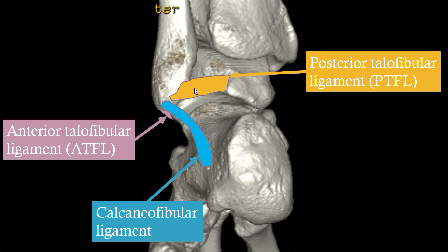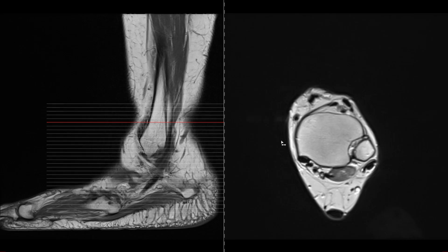This view shows the course of the posterior talofibular ligament, running from the back of the tip of the fibula onto the back of the talus. Now let's go through some cases and have a look at how you can identify these ligaments.